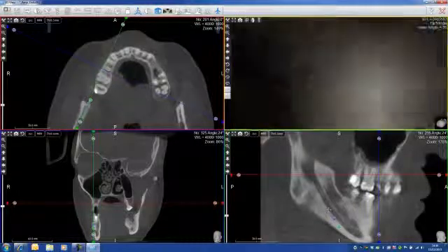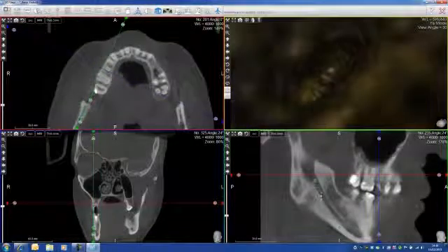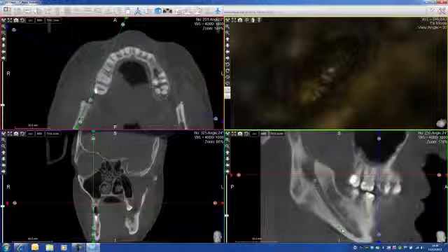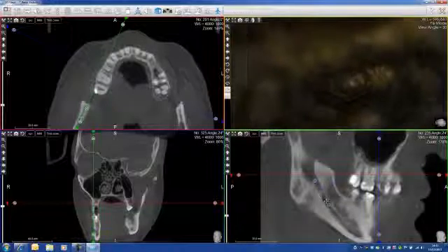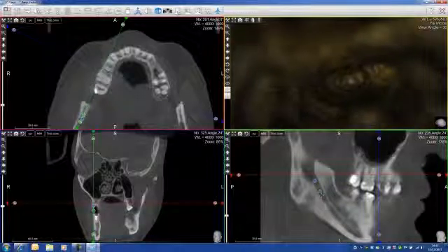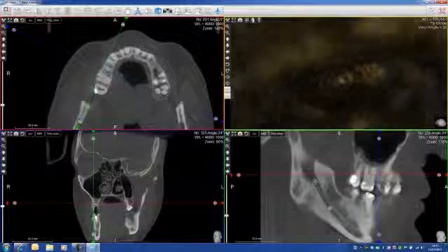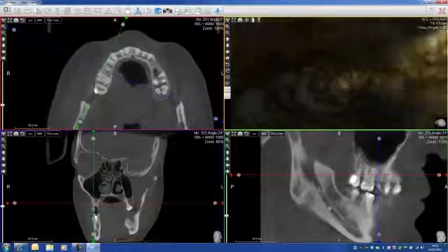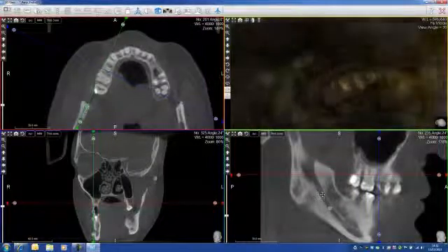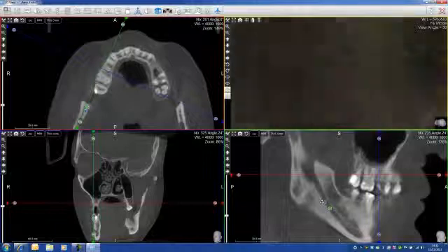A bit too fast — I go back. I put my camera here, set the target. And I can simply navigate through by using the little camera, going right inside the mandibular canal.